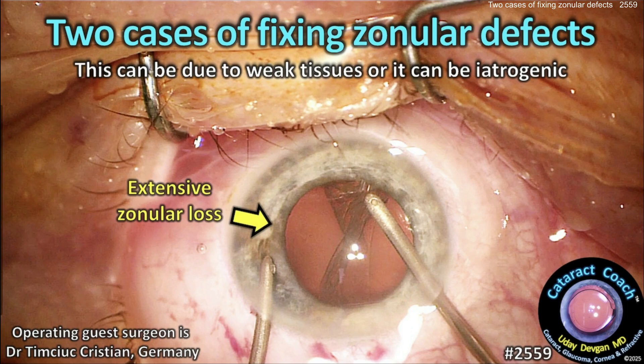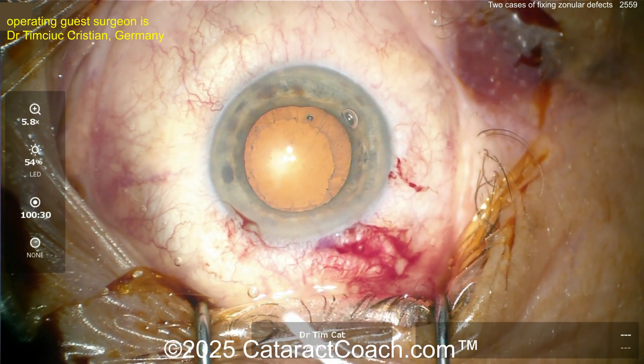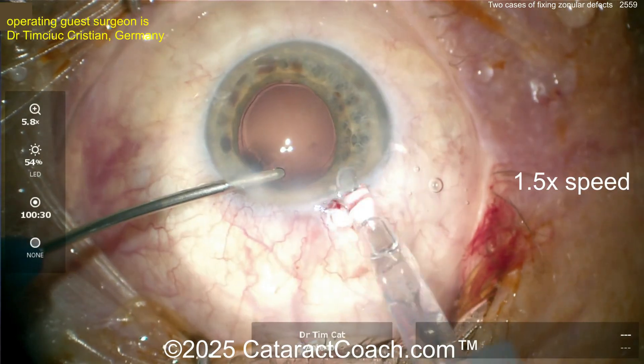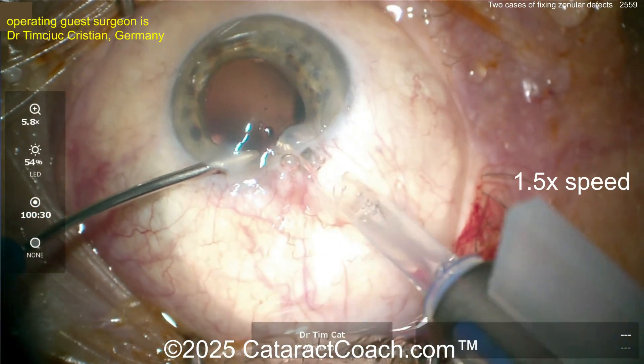cataractcoach.com — two cases of fixing zonular defects. This can be due to weak tissues or it can be iatrogenic; regardless, we've got to fix it. The first case here: pseudoexfoliation syndrome — a lot of pseudoexfoliation material there, good dilation. Here's the end of the case; everything seemed routine.